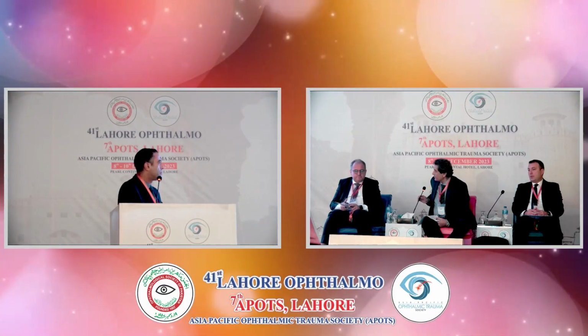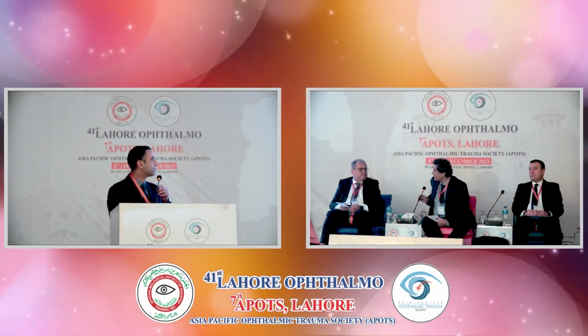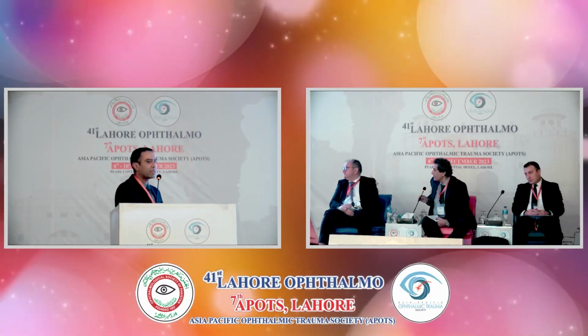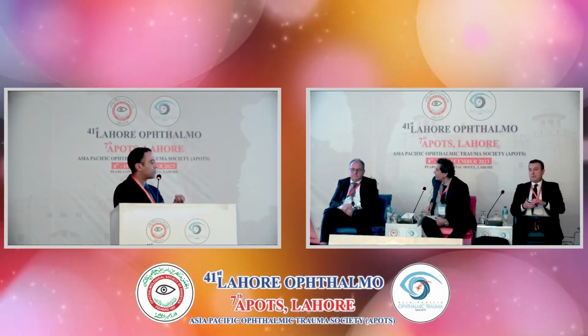I have a question. When you choose to select a patch graft, what do you think is the ideal place for it? Well, the first choice is usually an ILM flap. If you're choosing between a retinal patch graft or an autograft, I usually don't do an autologous retinal graft as a primary choice. My primary choice in a macular hole up to 1,000 micron diameter.